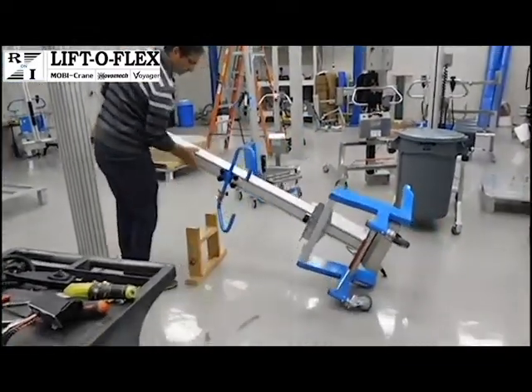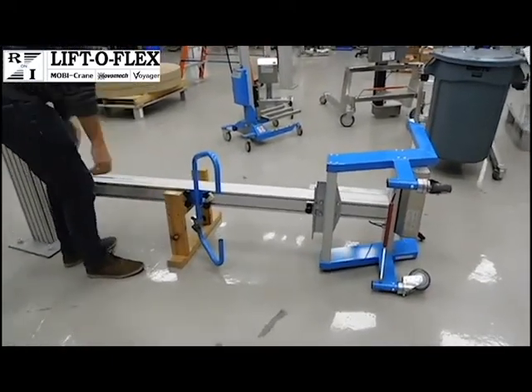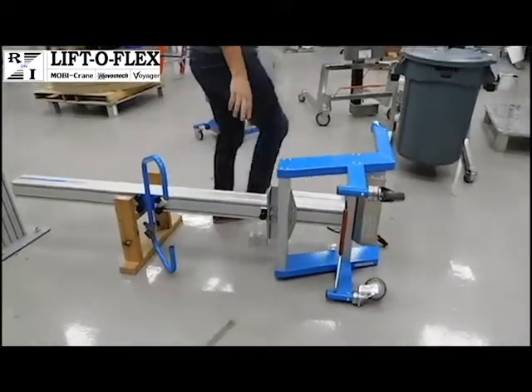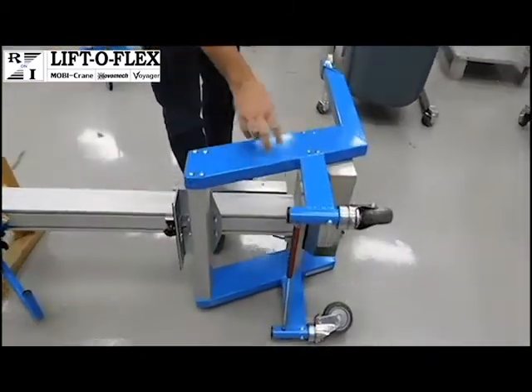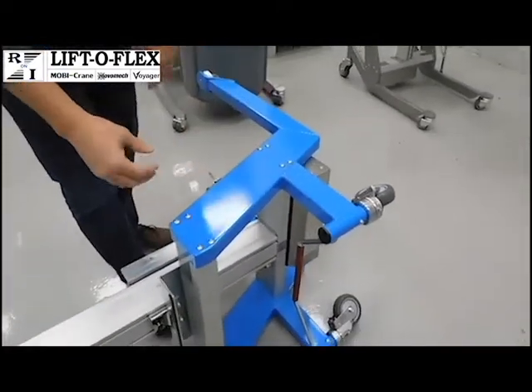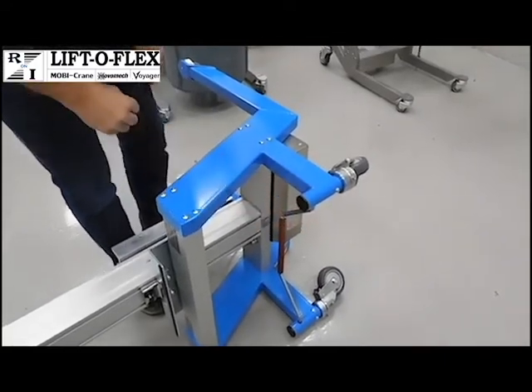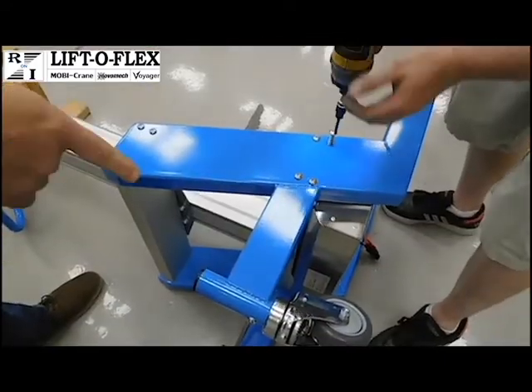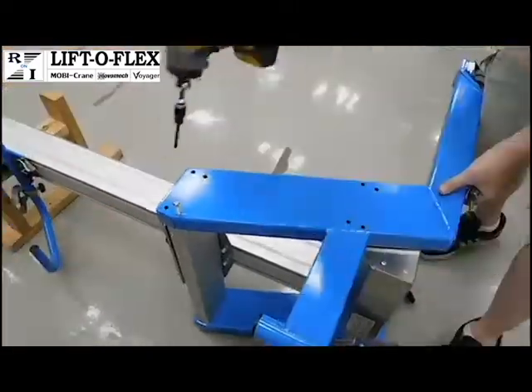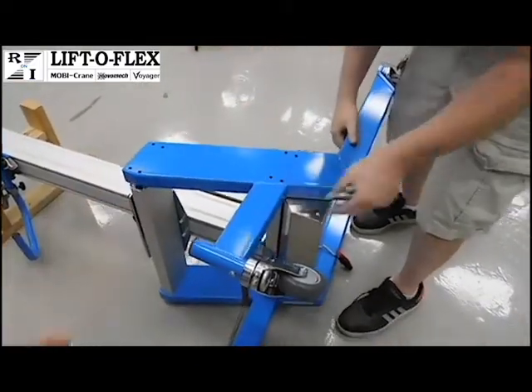We have a small stand we use. This can be done on a bench if needed. That will support the lifter. And then the next step is there's 8 bolts that hold the leg to the intermediate frame. Those will be removed in order to release the leg so that the caster can be removed. This requires a 5mm Allen wrench to remove the bolt. And this will allow the leg to be removed from the lifter.